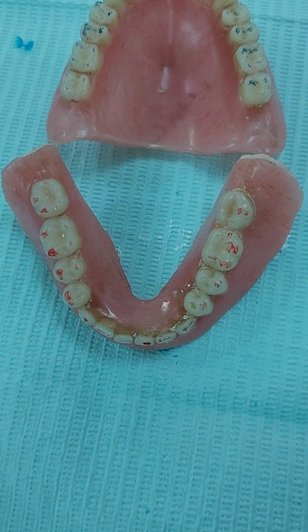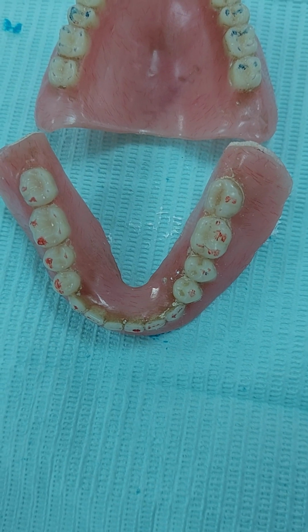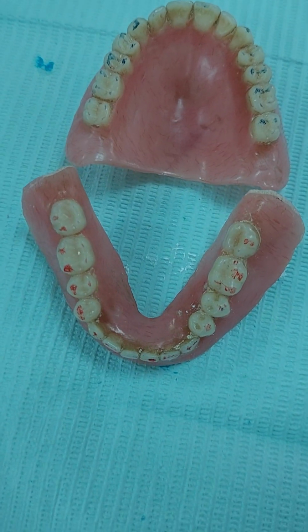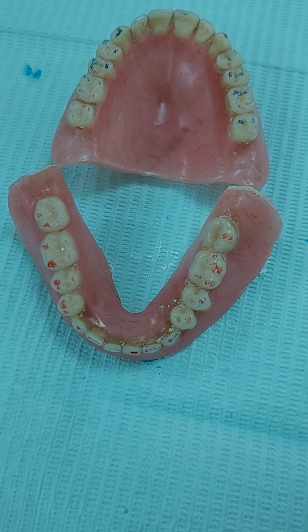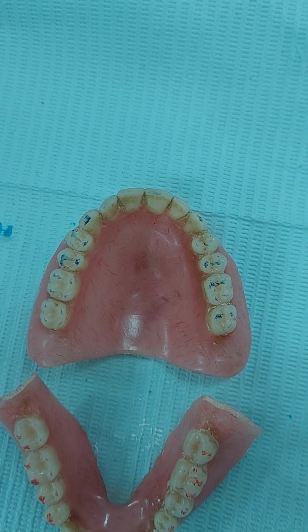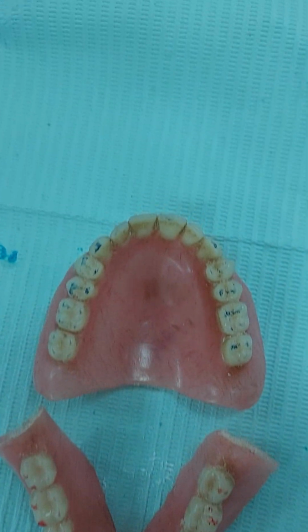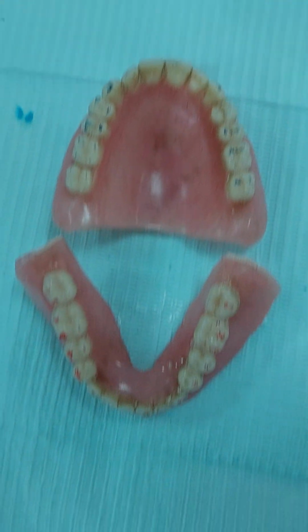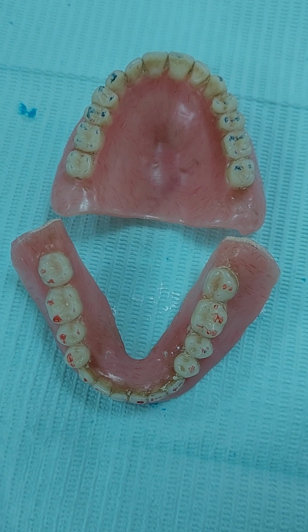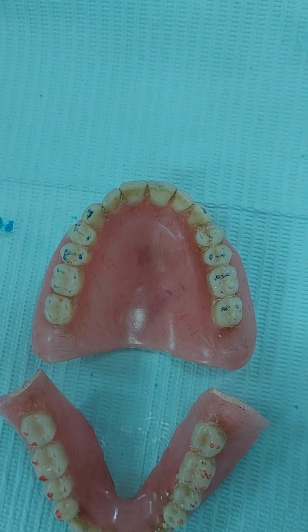Now, going back here, functional cusps on the lower alone are acceptable if I'm doing lingualized occlusion, or something similar. But still, they should have even marks on the upper. So if I'm using the buccal cusp of the lower as the cusp taking the bite, they should not have uneven bites here. There is another way of doing lingualized occlusion, making the palatal cusps of the upper bite on the lower. There I should have all of the functional cusps with dots, and the lower having even dots. But in this case, we are using the opposite, where the lower functional cusps are the main functional cusps. They should have very smooth guidance left and right.